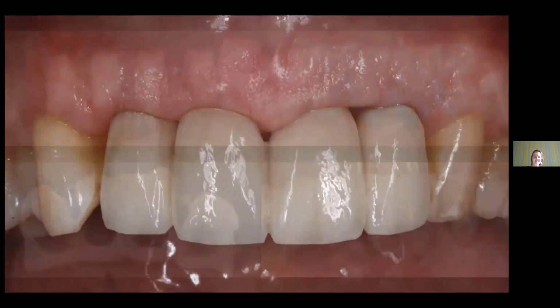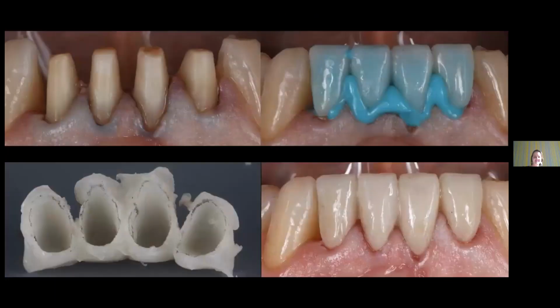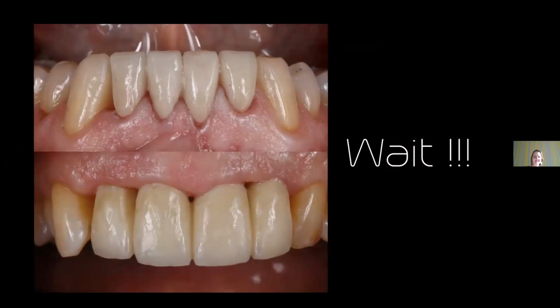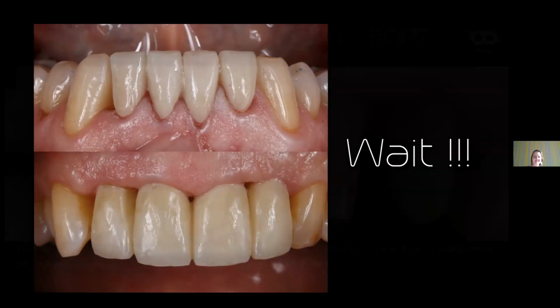Then the process was repeated at the bottom here, where there were no restorations to remove. In other words, we prepped the teeth marginless vertical. Same process: temporaries were already there, chair side, and we relined them and retrofitted them. Then we need to wait for the soft tissue to heal. In this case, I think we waited 6 months for the patient to come back.